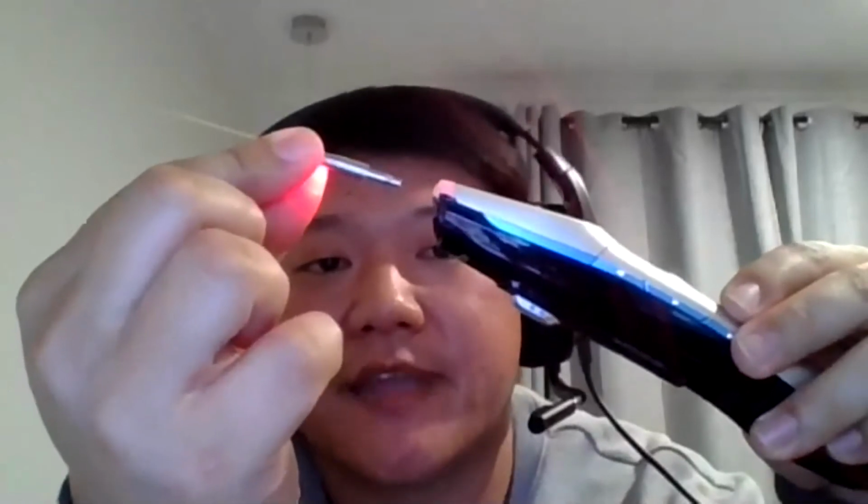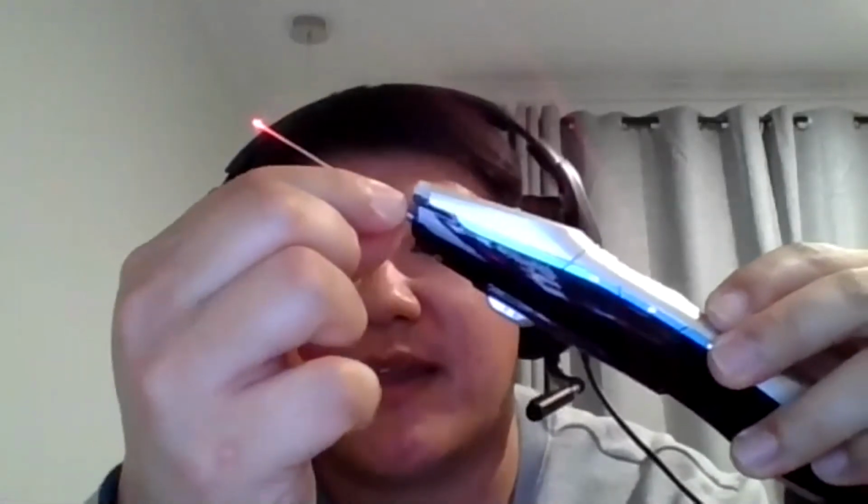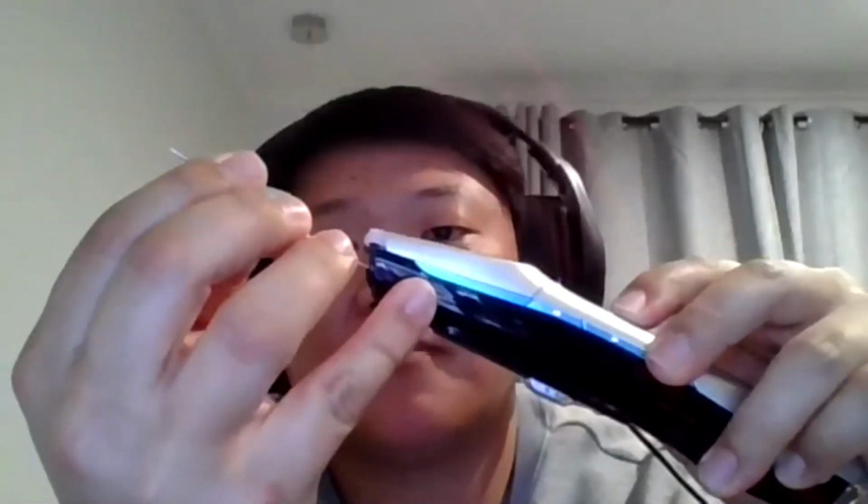You want to remove the steel cover from the top, and push this slider all the way up to the top. What you'll notice is it's a little magnetized application, and you just slot it through the gap. It'll slide on, and there'll be a magnet that holds it in place for you. Then you can withdraw the slider all the way back, and place your tip through here like so. That's now ready to go with the laser, and you can extend it out as far as necessary, and you can bend this tip to whatever angle. This is the really cool thing that I like about the laser: you have multiple configurations in terms of length and angles, and I think there's no other handheld diode laser that actually comes close to it.